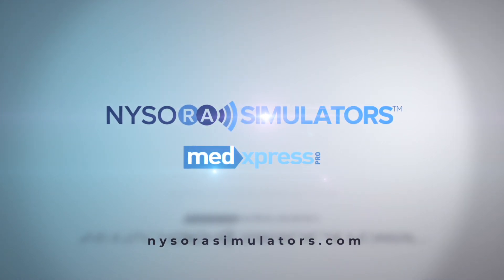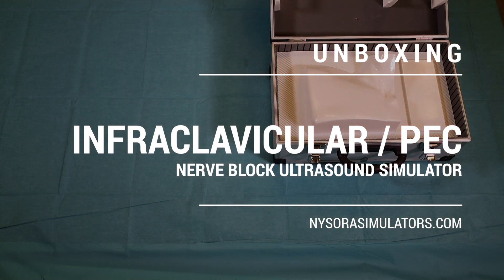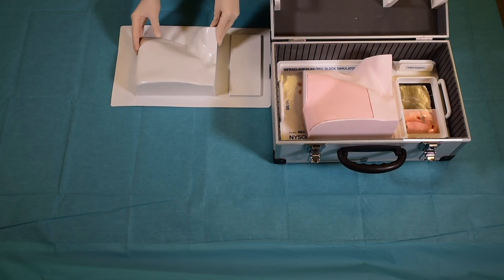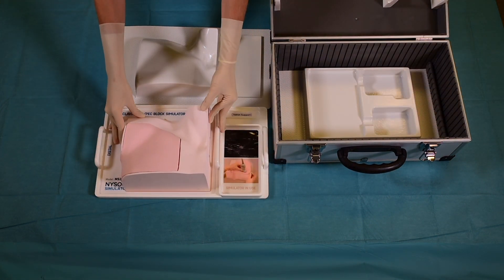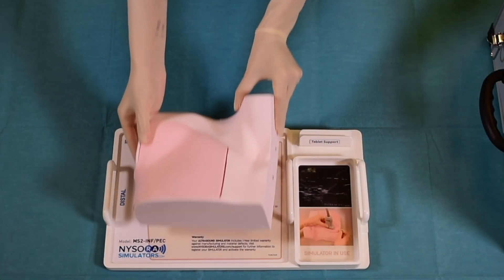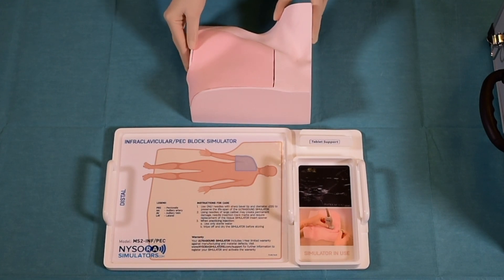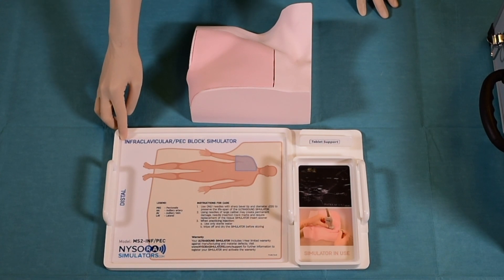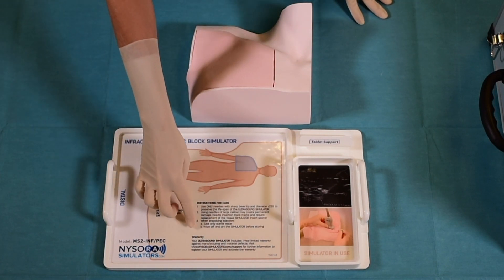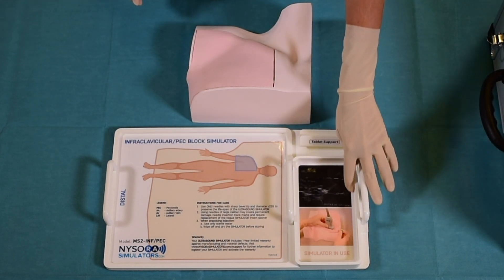In this video, we will briefly describe the infraclavicular and pec blocks NYSORA simulator. To begin practicing, the simulator is first taken out of its custom-made box onto its custom-made tray. Clear labeling is provided on the tray that indicates where the simulator belongs on the human body. Instructions for use and care are also provided, as well as descriptions of the abbreviations used in the ultrasound image.